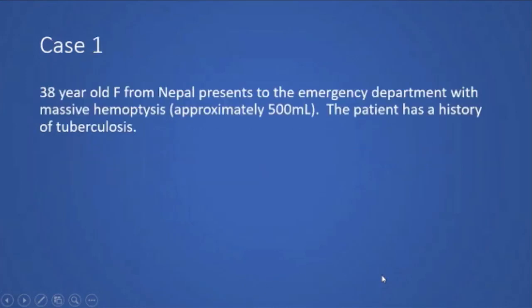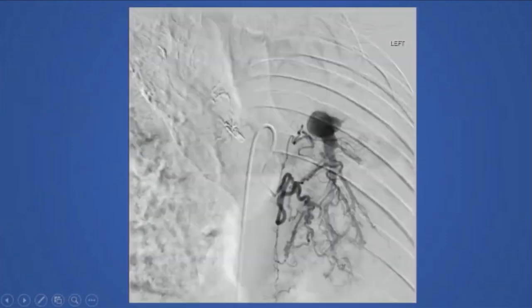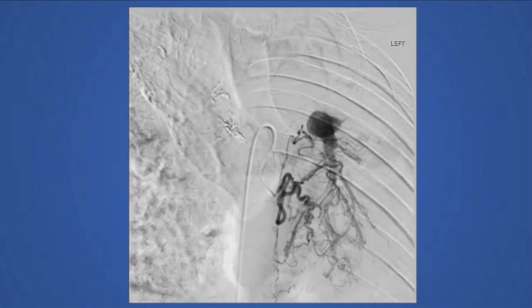The first case is a 38-year-old female from Nepal that presented to the emergency department with massive hemoptysis. The approximate volume was about 500 milliliters, and the patient has a history of tuberculosis. This patient was referred to angiography, and we have a reverse curve catheter that has selected the left bronchial artery. Once we select that artery and inject, we can see there is a grossly abnormal vessel.